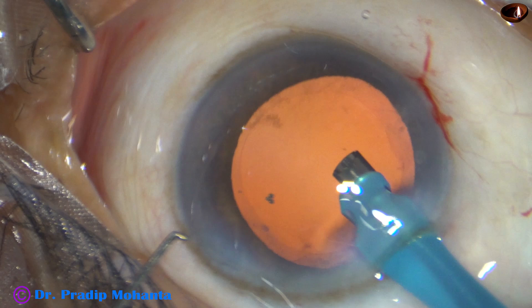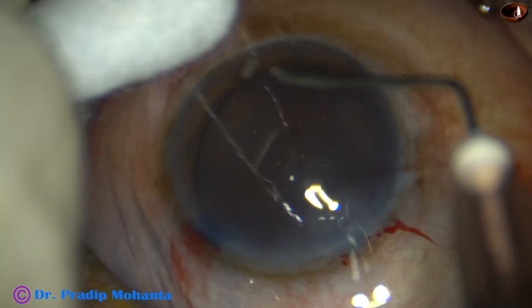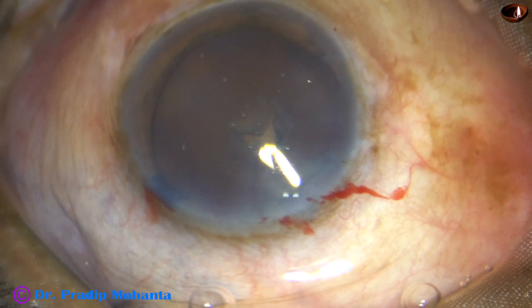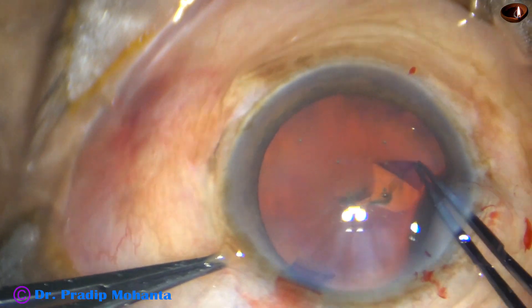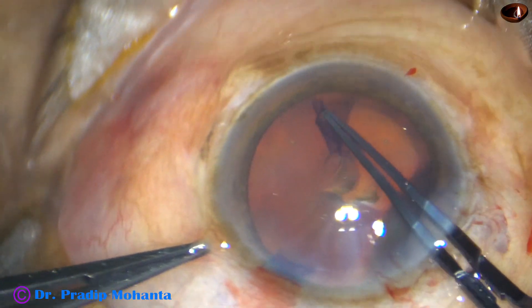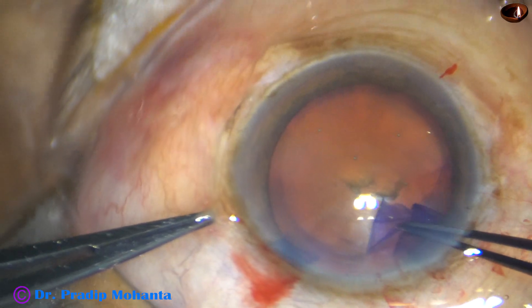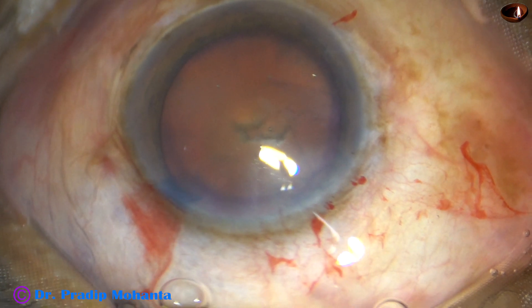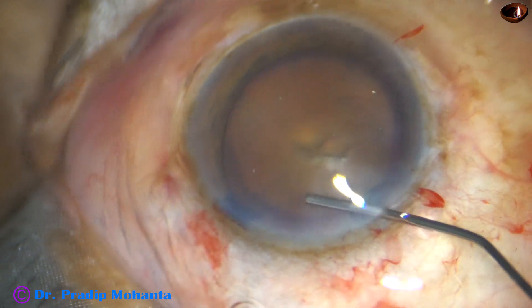Now we are going to see another case. This is the second case — the hardness of the nucleus is almost the same: grade 5 or grade 5-plus nuclear sclerosis. Capsulorhexis is being done after incision and staining the anterior capsule. A nice capsular tag is raised by the needle. I use the utrata forceps, hold the capsular tag and do a large rhexis. Though the cataract is brown and hard, because of omni-glow we are getting good red reflex. Now, hydrodissection.